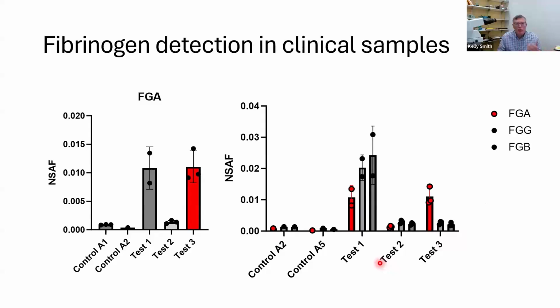And so this suggests that this is probably blood or clot, the type of fibrinogen that you see normally, a physiologic form of fibrinogen where we're detecting all chains, whereas our patient has high levels, but it really consists predominantly of fibrinogen A. And so that's abnormal, and that's then amyloidogenic.